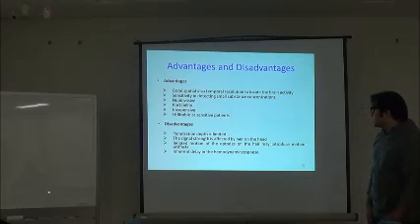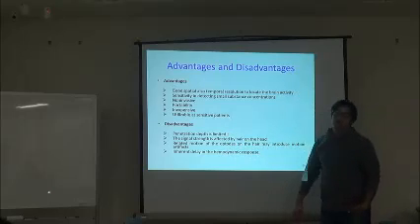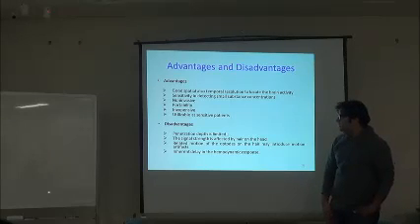And the disadvantages include, number one, the penetration depth is limited. As we said, it's around 3 centimeters. So in case of adults, we cannot go deep into the brain. That's one of the disadvantages.